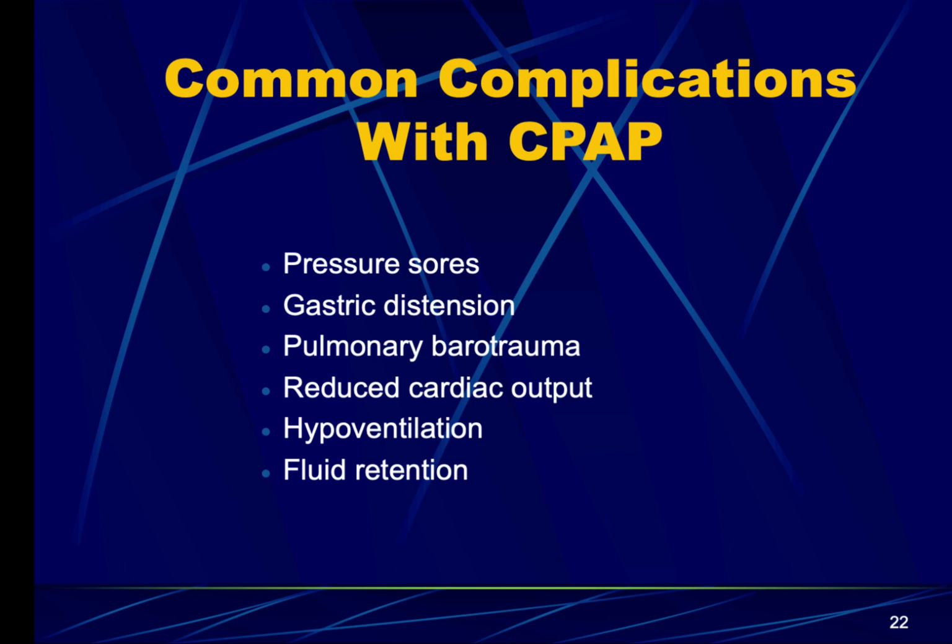It's sensitive to intrathoracic pressures, so we're going to decrease the actual preload back to the heart. We're going to decrease the blood flow going back into the right atrium. If we decrease that preload, we can start decreasing cardiac output as well. And if we decrease cardiac output, we can decrease the cerebral perfusion, which is going to change the mentation of your patient.